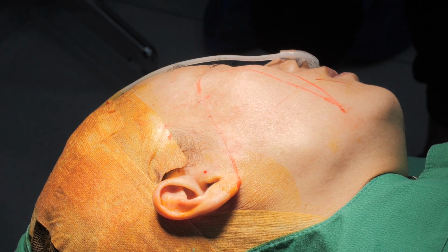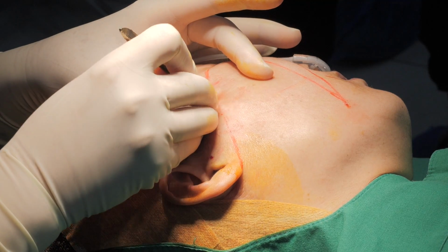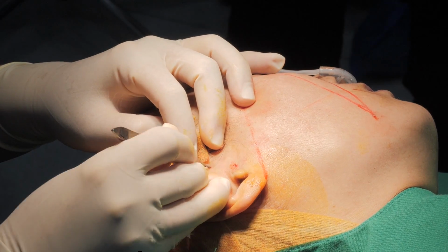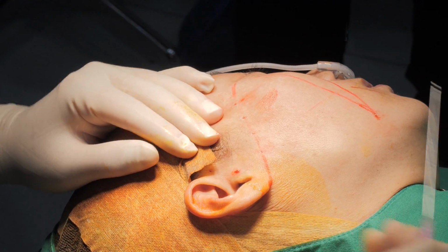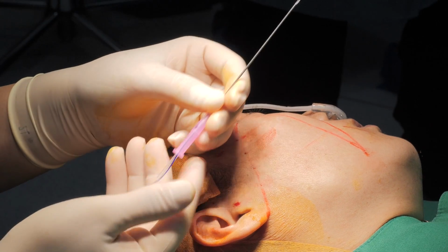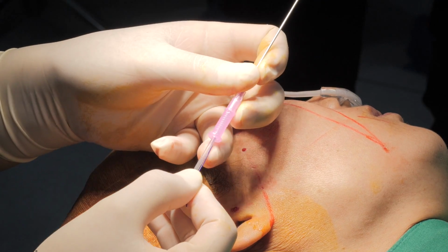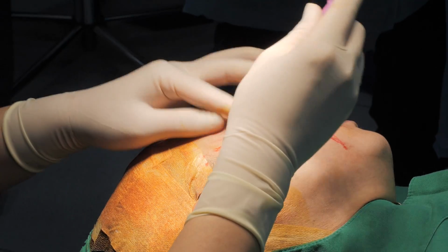First of all, I make the hole wider with forceps. What's this? WA cannula. And what's this? The negative cog. It's Cogmaster Gear 6. Great. Thank you.